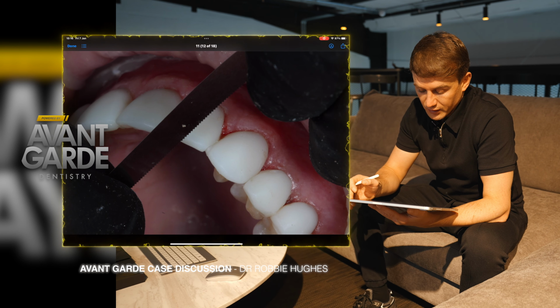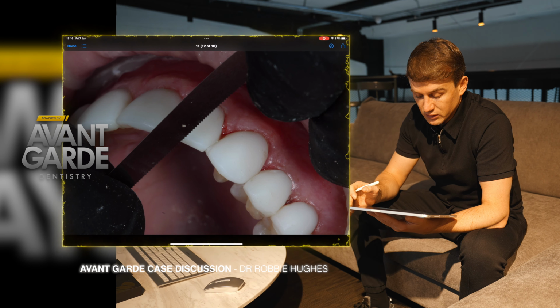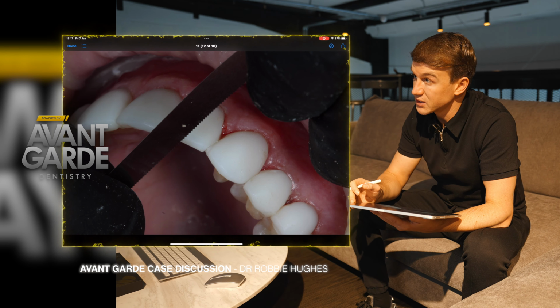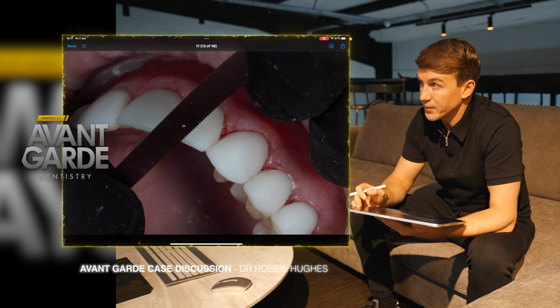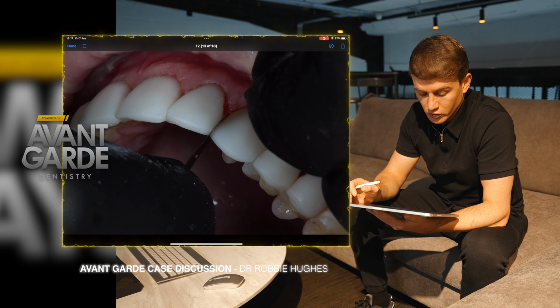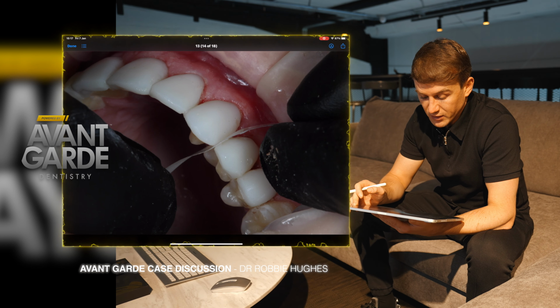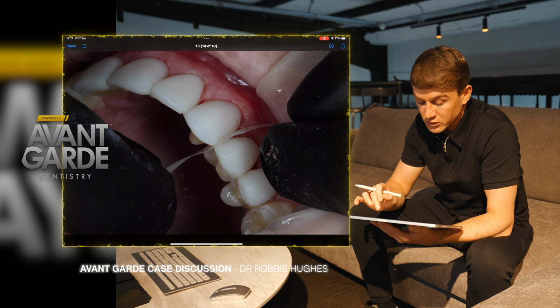Then we can move with our serrated saw again, just to make sure that the interproximal contacts have all been correctly shaped and smoothened out, to make sure there's no excess connecting the composite, which there shouldn't be because the tape has already separated the teeth and we've injected independently every other tooth. The saw goes through. That just allows you to make sure your contacts are there and accessible. Then we can start to use polishing strips in the contacts, again to make sure there's no excess, no ledges, and everything is nice and smooth and nice and cleansable.